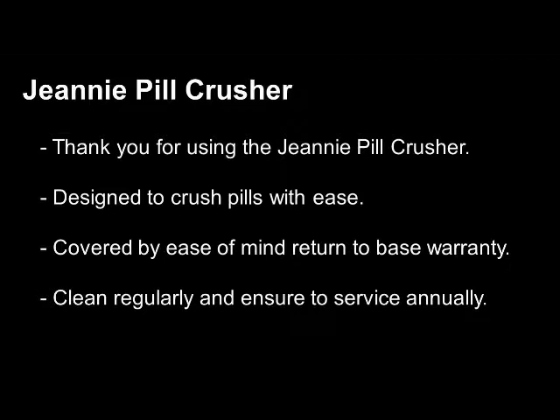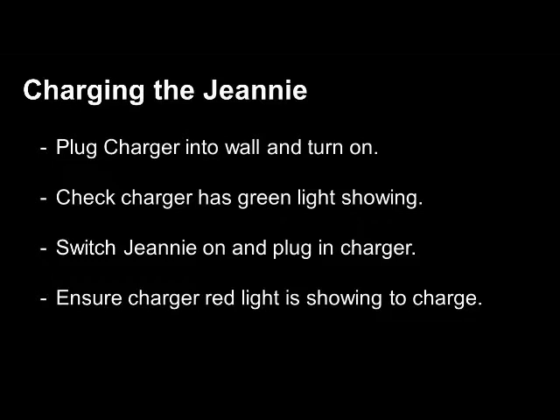To ensure maximum reliability, the Genie Pill Crusher must be charged. Please plug the charger into the wall and turn on. Check the charger has the green light showing. Switch the Genie on and plug in the charger. Ensure the charger red light is showing to confirm charging once the Genie has been plugged in.